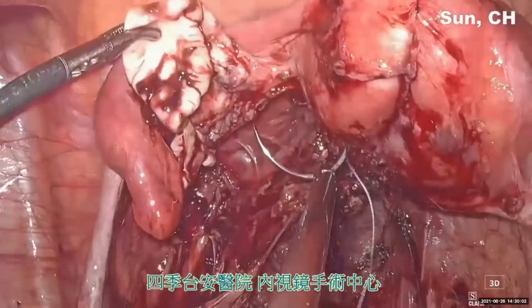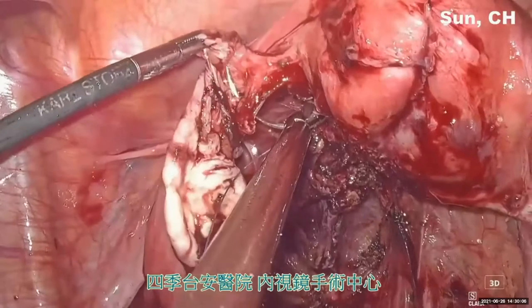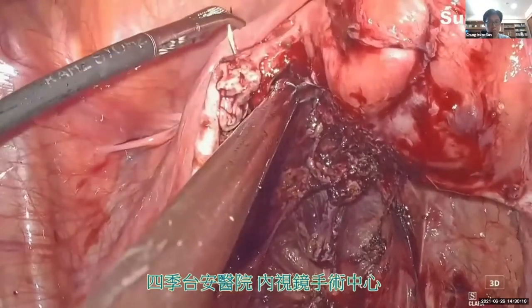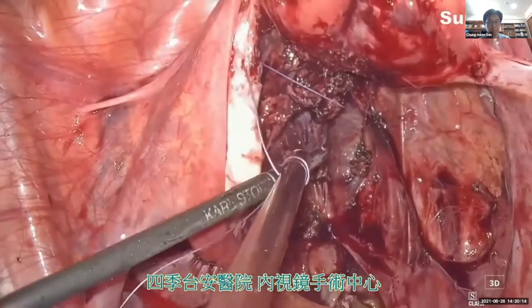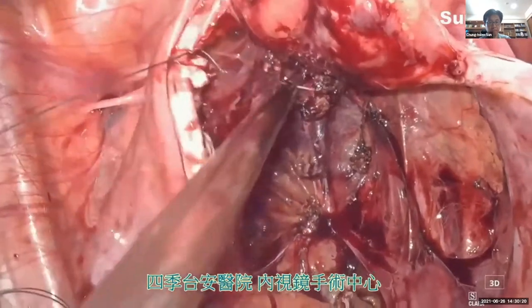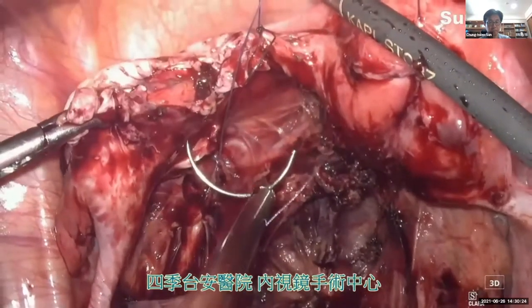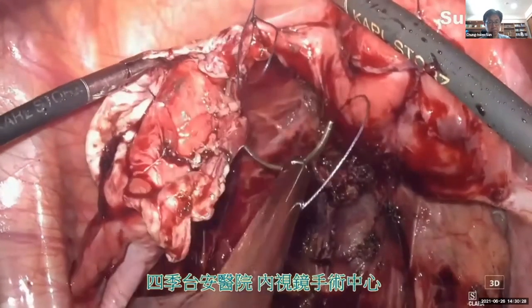Okay, now we have completed the cystectomy. Now we are going to approximate the residual normal healthy ovarian tissues. I am not using any energy to make hemostasis. The suture material is 3-0 Vicryl suture, which is absorbable.